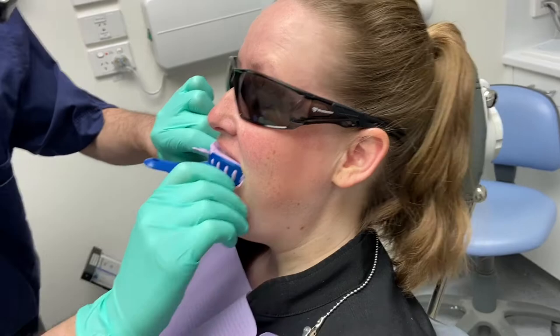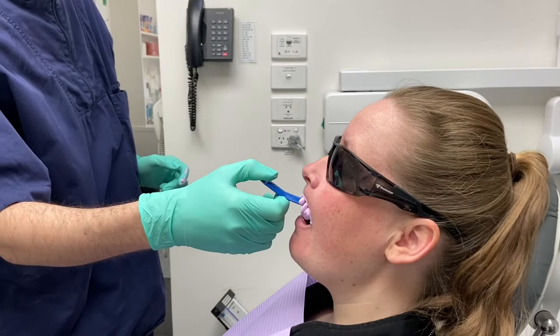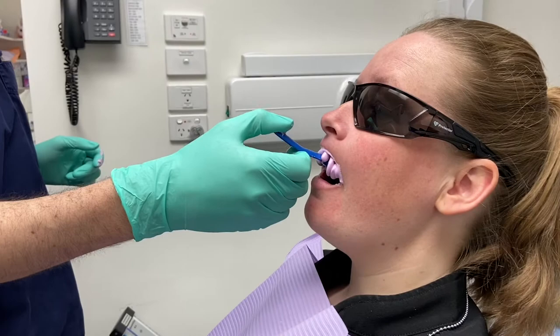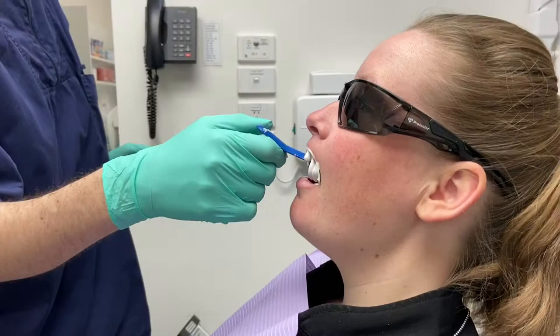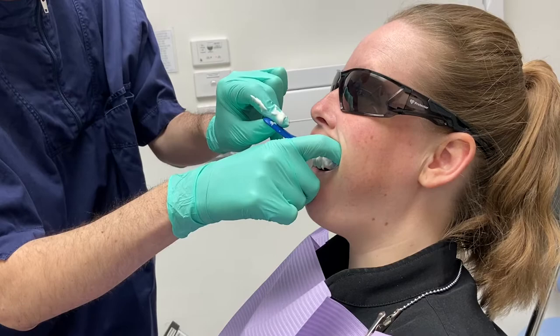This then goes into Jess's mouth. It does take a little bit to set, so I'll fast-forward through this process, but essentially it gives an accurate mould of your teeth so the trays fit really nice and snug. The impression material has hardened now, so Dr. Chris Bott will take that mould out when he feels it's ready.